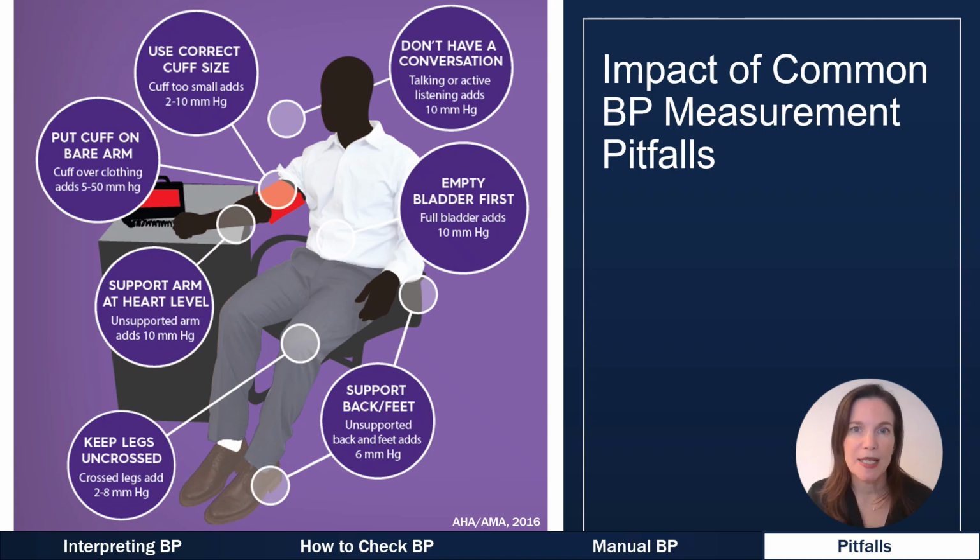It can be very tempting to skip some of these steps, especially in a busy clinical setting, but they really are all important for ensuring an accurate blood pressure reading. This graphic looks at the potential impact of failing to follow some of these best practices. If a patient is talking or even just actively listening while their blood pressure is being taken, it can add 10 points to the systolic blood pressure.